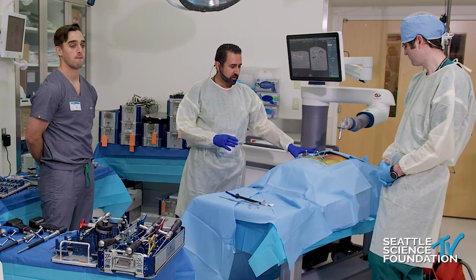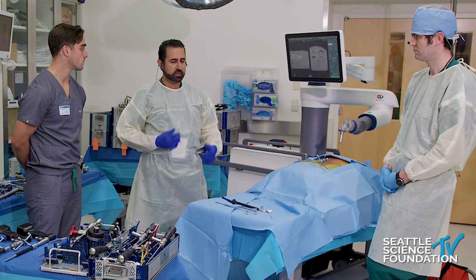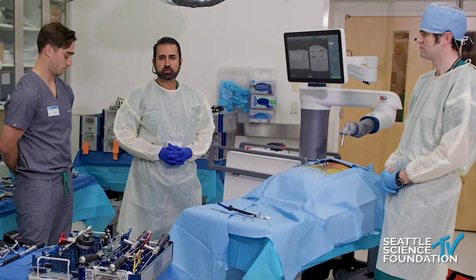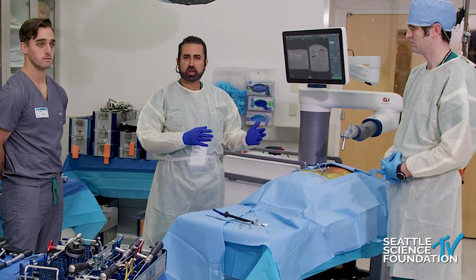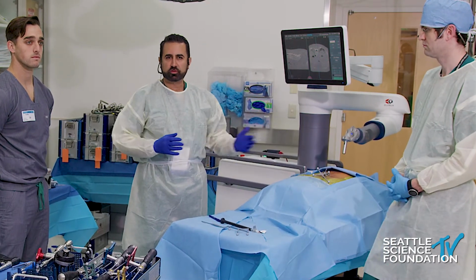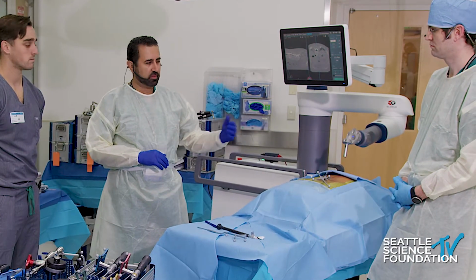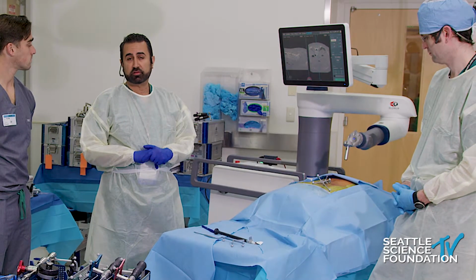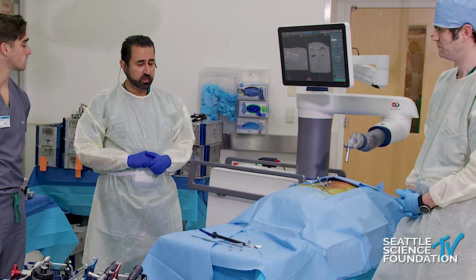But in brief here, you'll see that I'm not wearing lead. I hate radiation. It's been a feature of our lives as spine surgeons, those of us who trained under fluoro, and then navigation with, say, O-arm and Stealth came into the field, reduced a little bit. We're at the point now where we could reduce radiation a lot. The next big thing is, of course, accuracy, and I think there's a lot of data that shows that robotics has equivalent, if not better, accuracy with respect to screw placement and reliability as well.